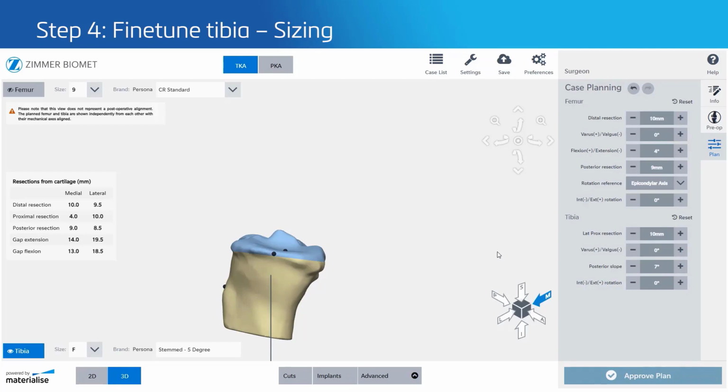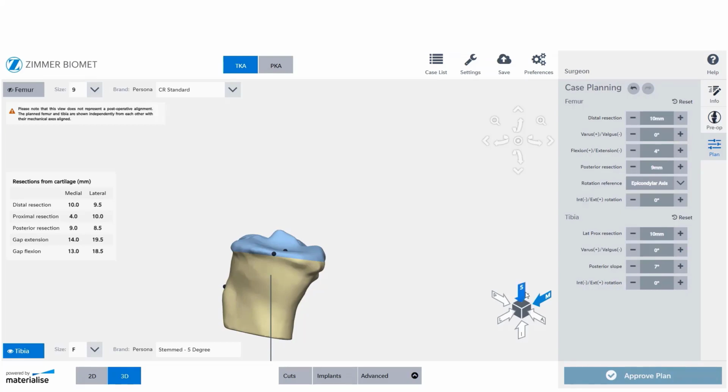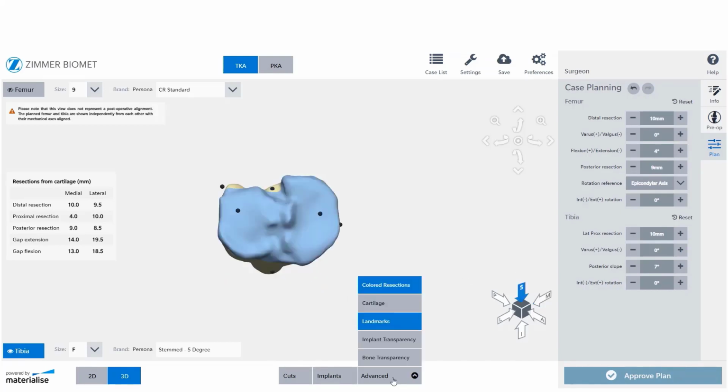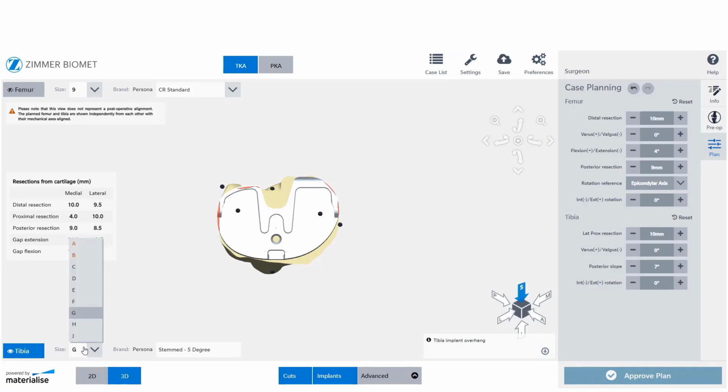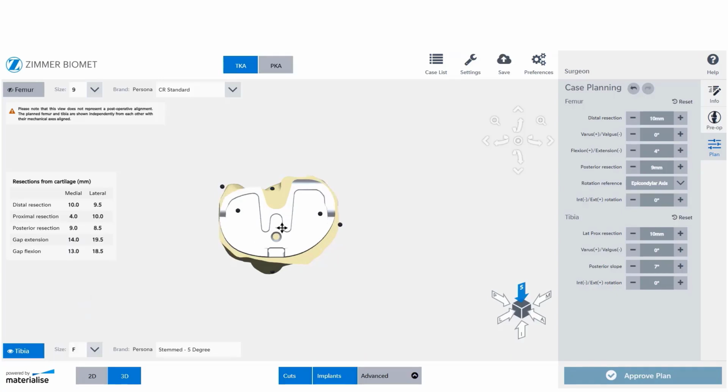Now, review and adjust sizing. Move to the superior view, switch off colored resections, and switch on implants. You can try one size smaller or one size bigger and verify implant fit. It is easy to verify overhang. Overhang will be shown in red. You can modify the AP and ML position of the implant interactively.